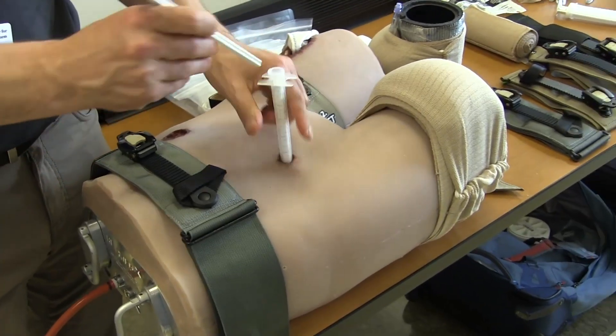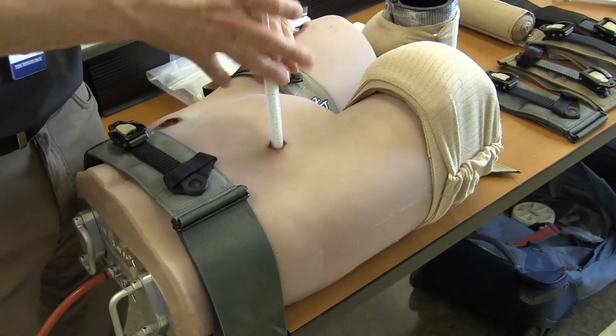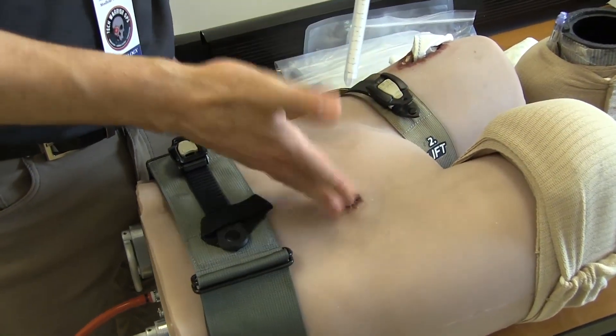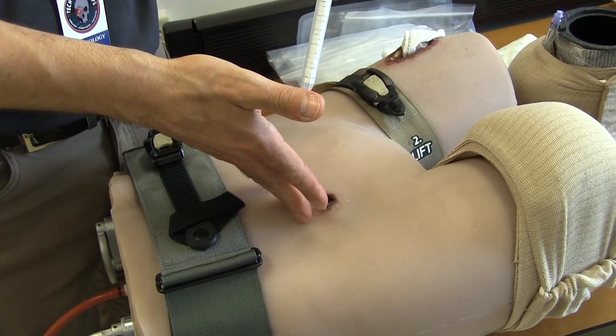This mannequin is made with a durable yet realistic industrial silicone. Designed to endure repetitive daily training, it can be a valuable part of any crawl, walk, run training program.